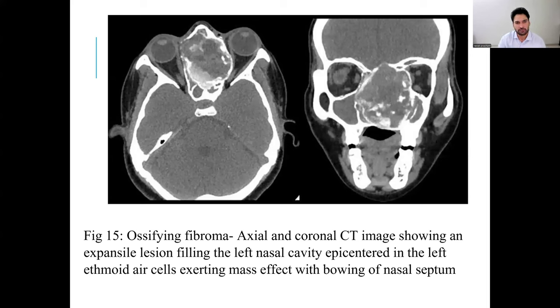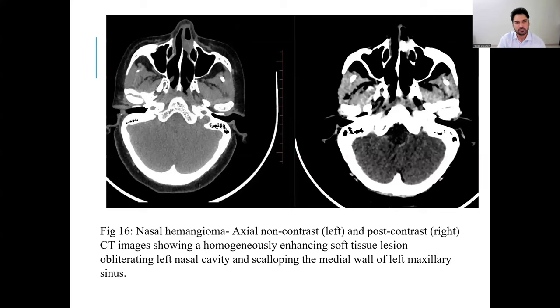In axial and coronal CT images, we can see ossifying fibroma showing an expansile lesion filling the left nasal cavity, with the lesion epicentered in the left nasal cavity exerting mass effect with bowing of the nasal septum. A nasal hemangioma case shows axial non-contrast on the left and post-contrast on the right, demonstrating homogeneous enhancement of the soft tissue lesion obliterating the left nasal cavity and scalloping the medial wall of the left maxillary sinus.